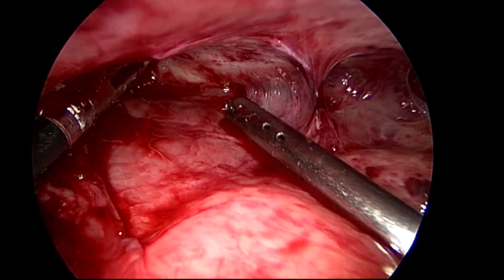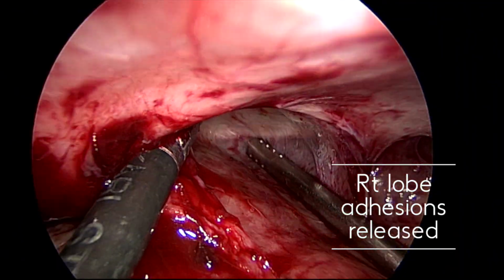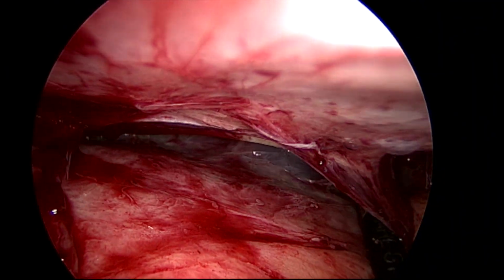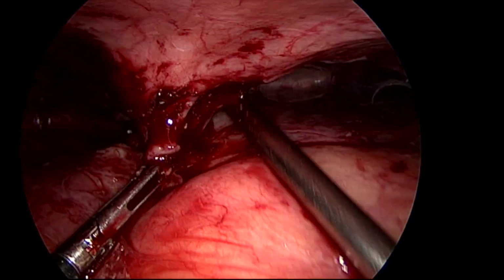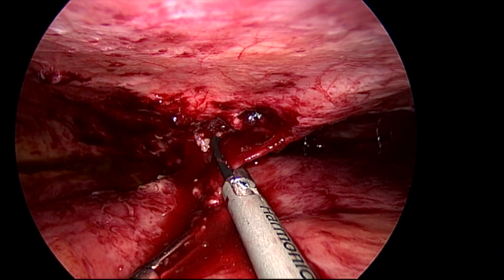So slowly I'm going towards the diaphragm. I'm separating the right lobe of liver from the diaphragm. You can appreciate here, these are all the adhesions of the right lobe to the diaphragm level. So I'm releasing it.